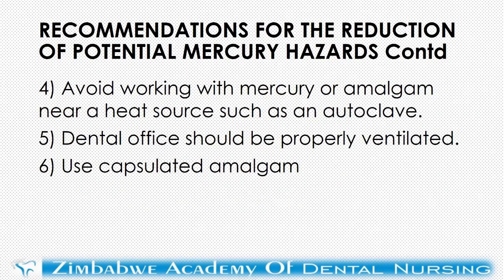And also avoid using amalgam directly close to heat, because that will force the mercury to evaporate into mercury vapor. Should have good ventilation in the dental surgery. Open the windows, have a fan running. And of course, thanks to technology, we now use capsulated amalgam.